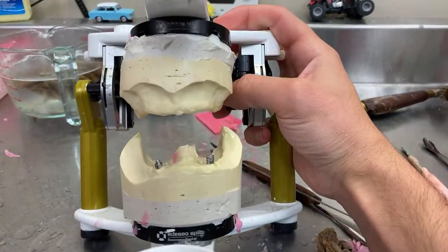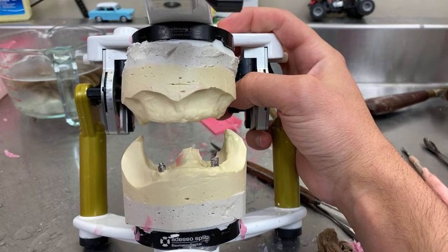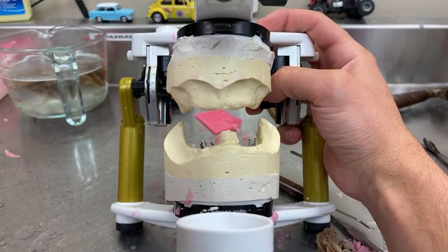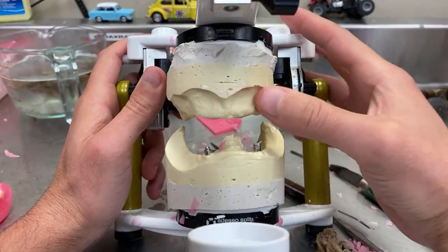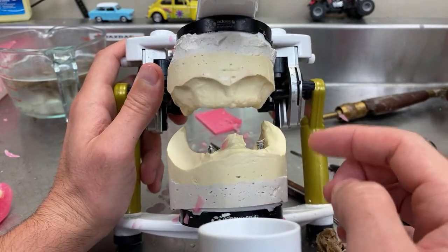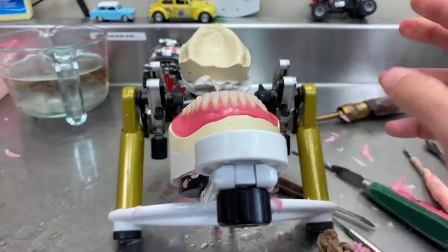See how it is when it's articulated? Look where the lower is sitting. And that's because this case was face bowed. And this is the relation we got, so we have to follow it. So what I did is I set the upper a little bit out in order to meet with the lower here. That's why you're seeing it lopsided.